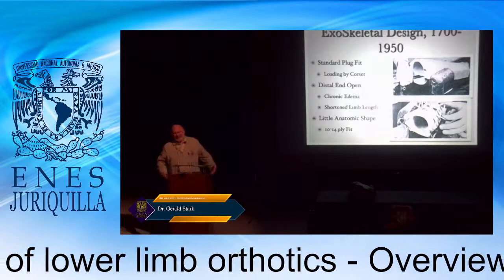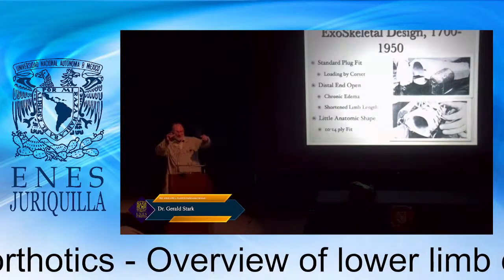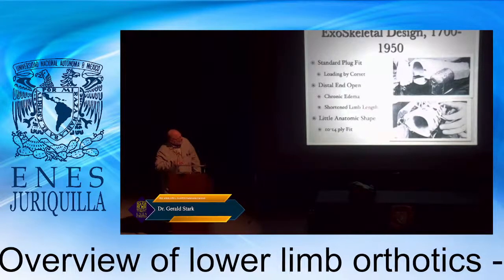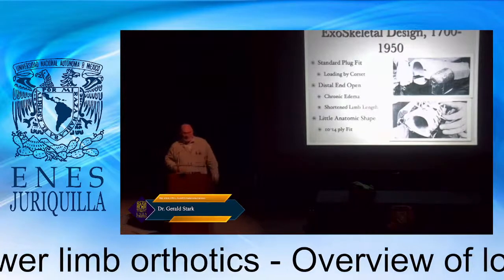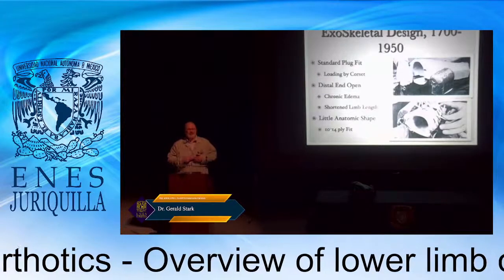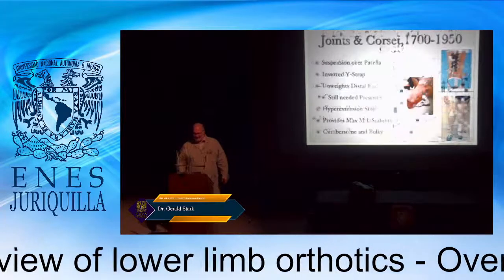It's much the same way the Aztecs made things, right? They would place the stone, and where the stone hit, they would scrape it away a little bit more, and that's how they could get such a tight fit. Then they would cut the wooden socket and compress it. So this is actually where the two-stage casting technique came from, but most of the time they were fit with 10 to 14 plies. So 3 to 4 pairs of socks on your feet. That's pretty much the way it was feeling.